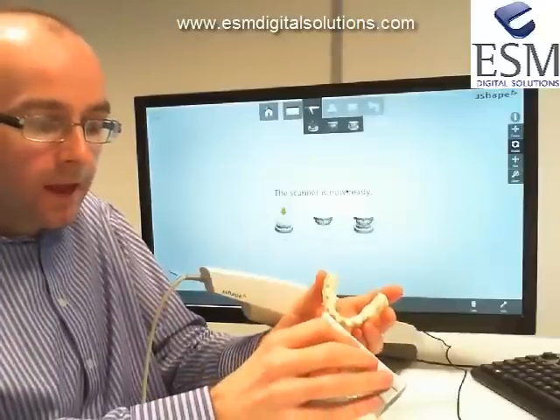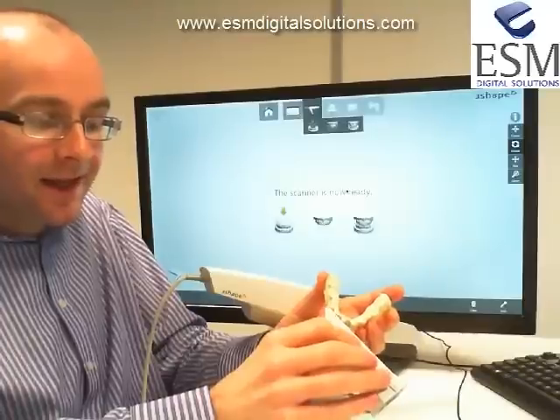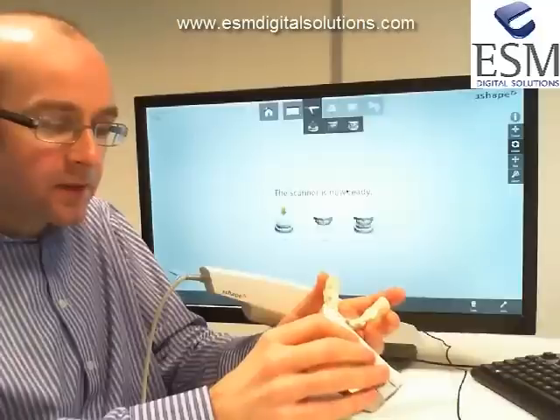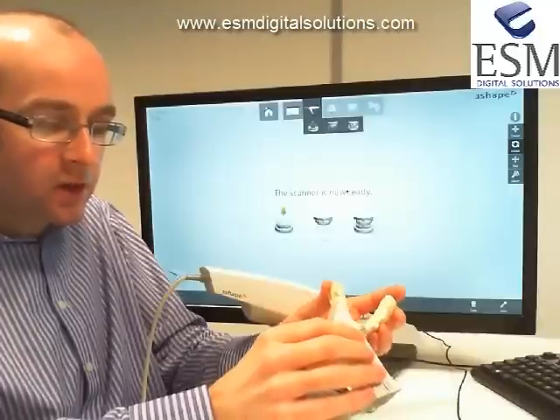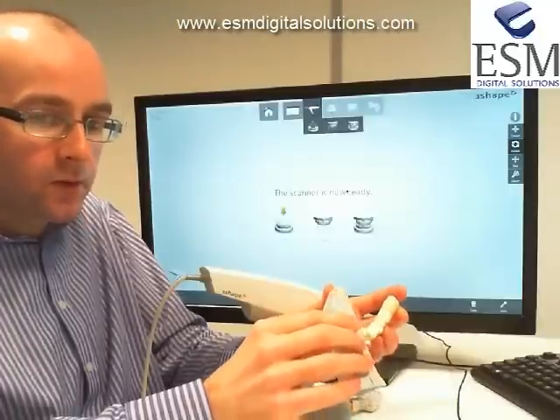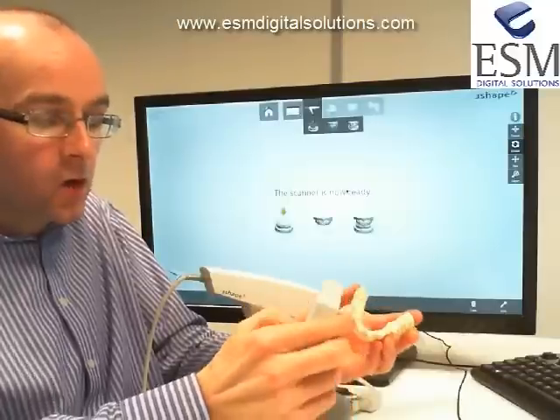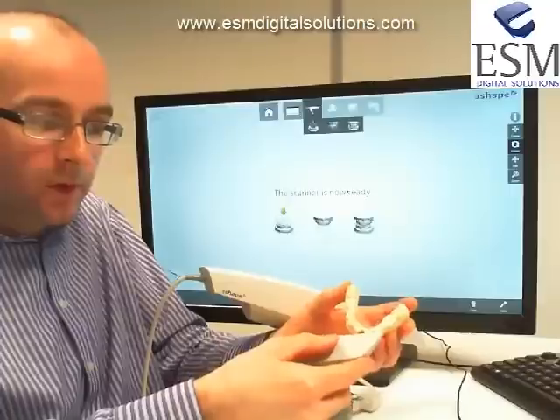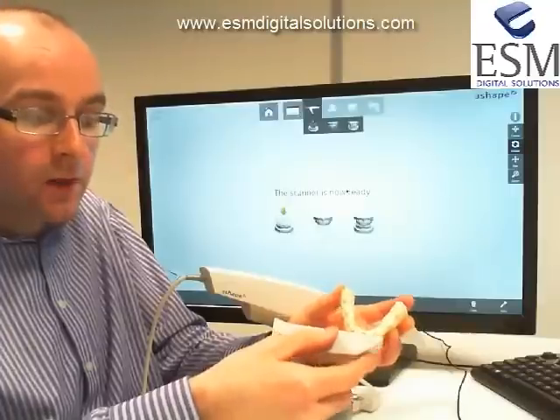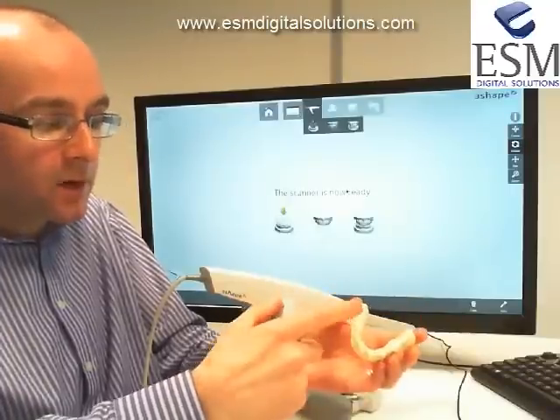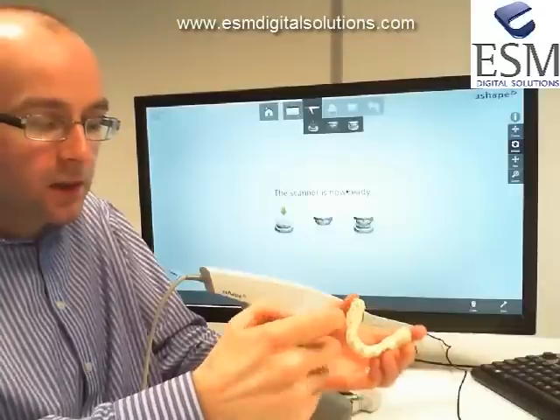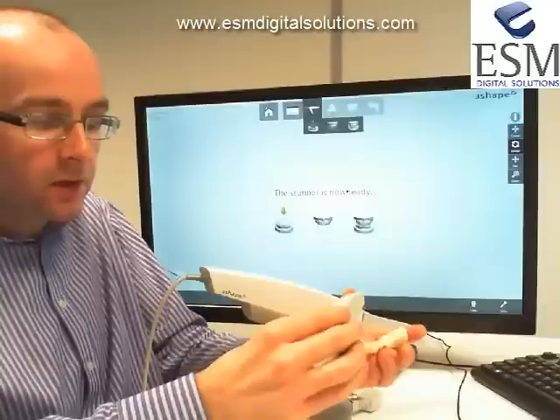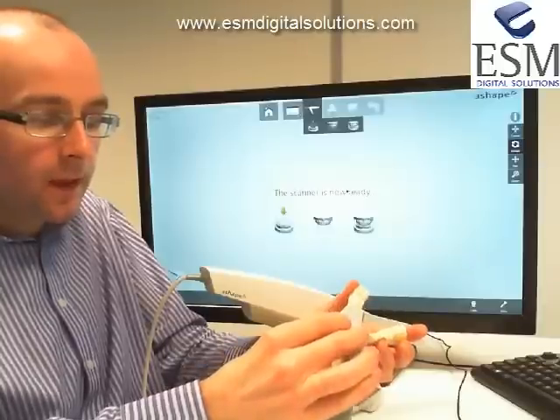We can pull away, make contact again, make sure the software is capturing data, and as soon as we get that indication we can push backwards. If we prefer, we can stop at the labial area and restart from that position. We indicate that to the software, restart from that position, roll over, and sweep forward. At that point we should have a really good scan.